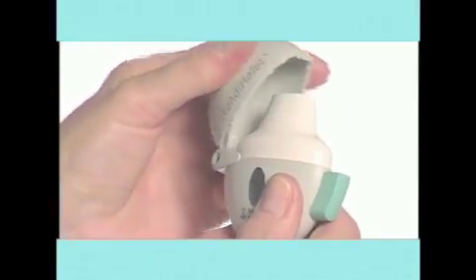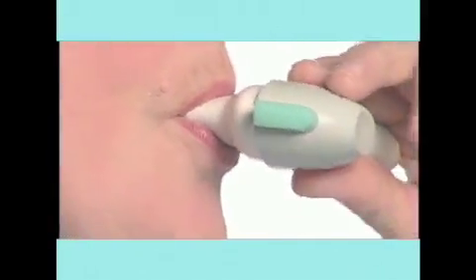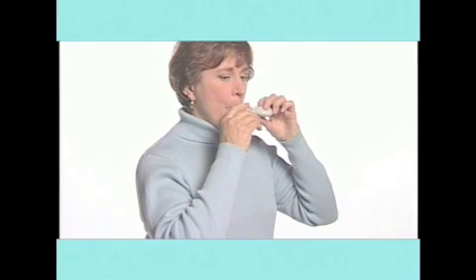The Handihaler is specifically designed for Spiriva capsules. This video will demonstrate how to insert a capsule, inhale the medication, and dispose of the empty capsule. Taking your medication is as easy as drop, press, and inhale.